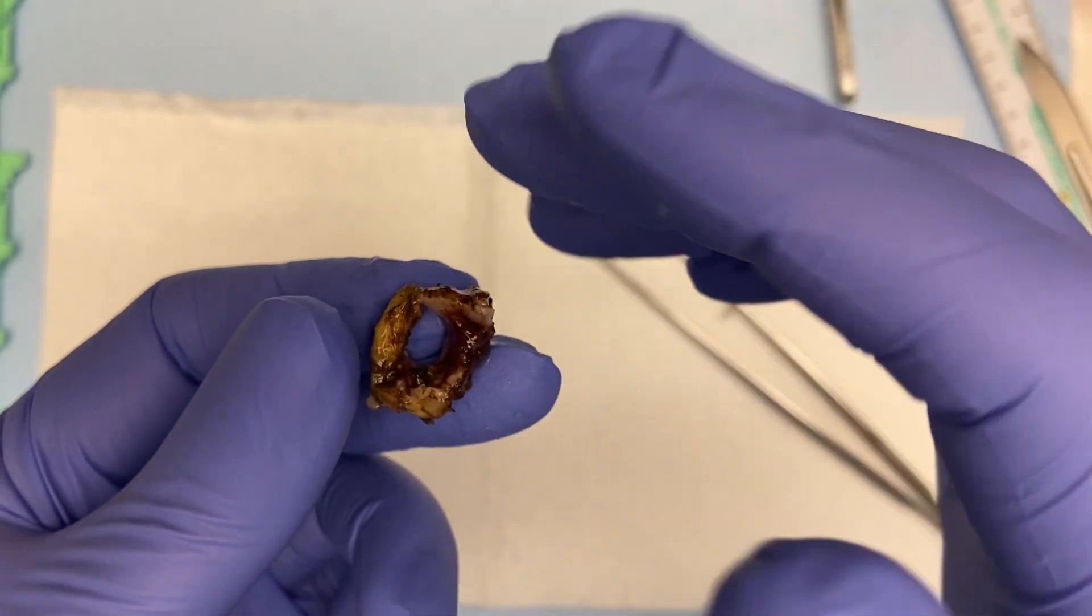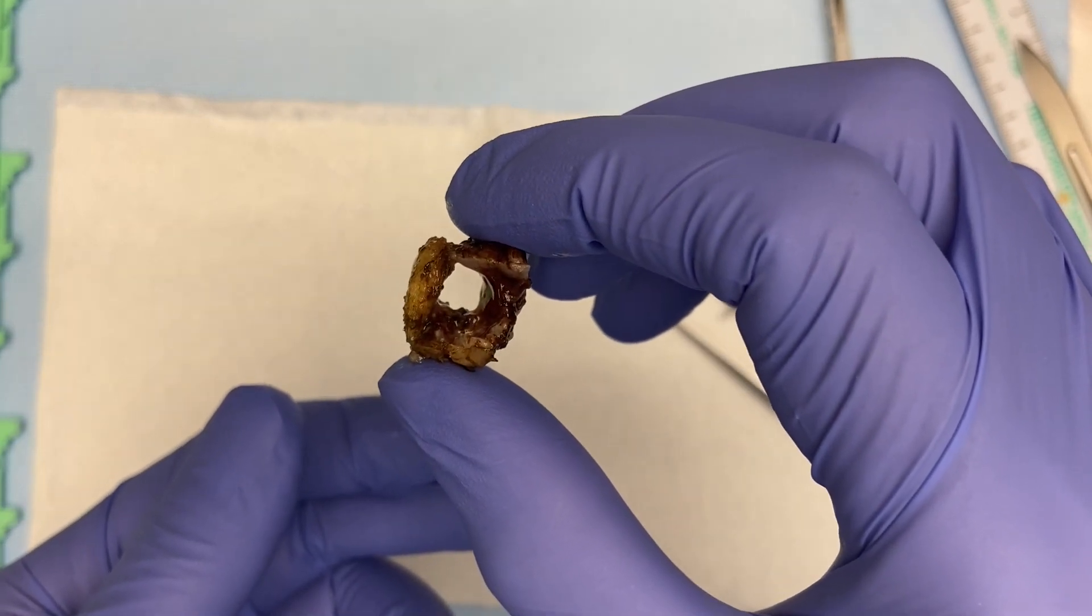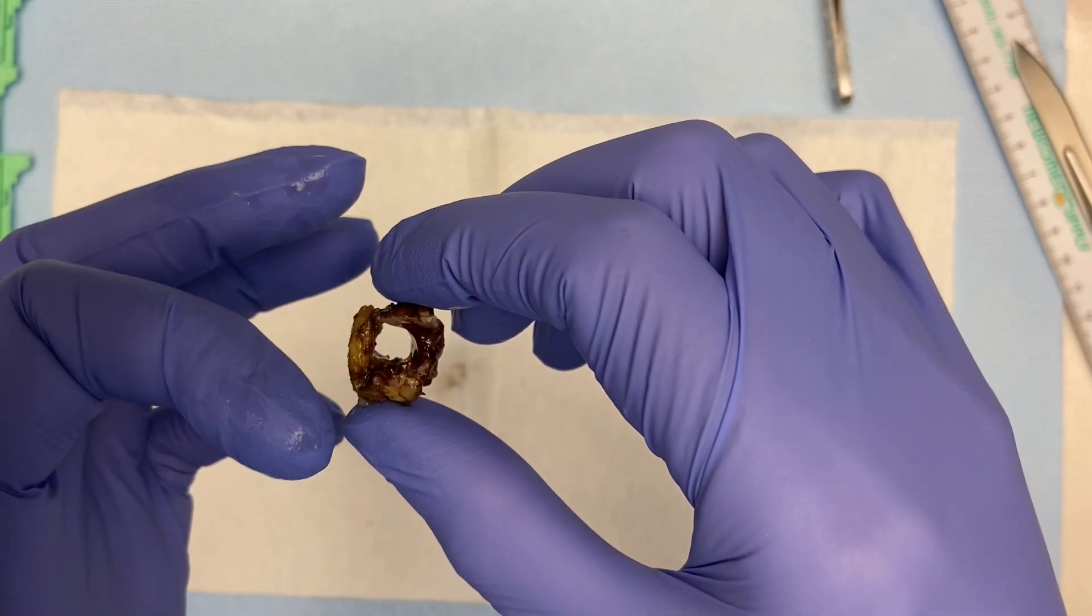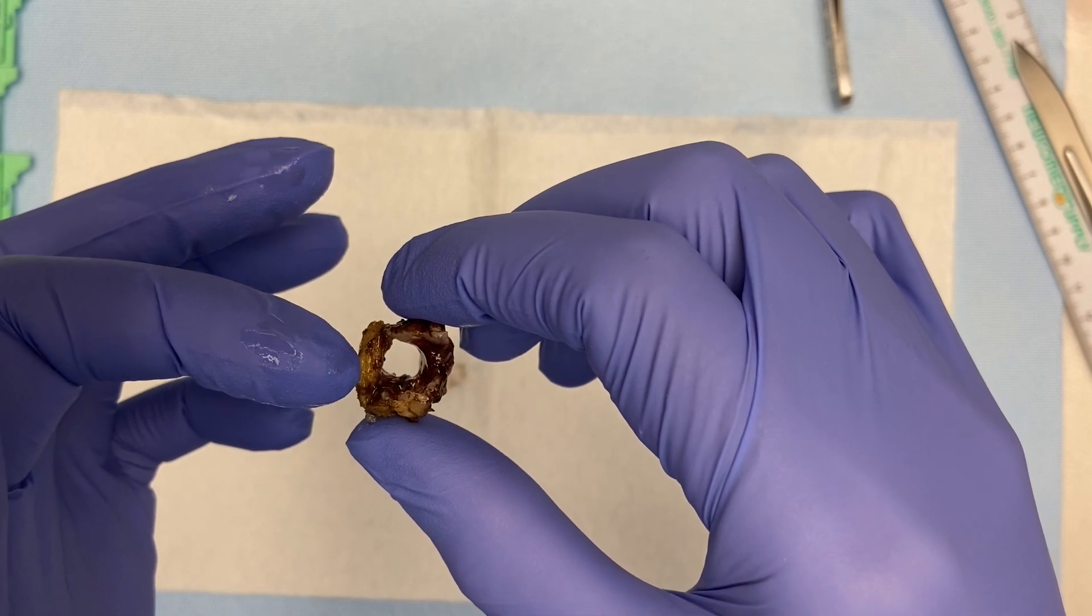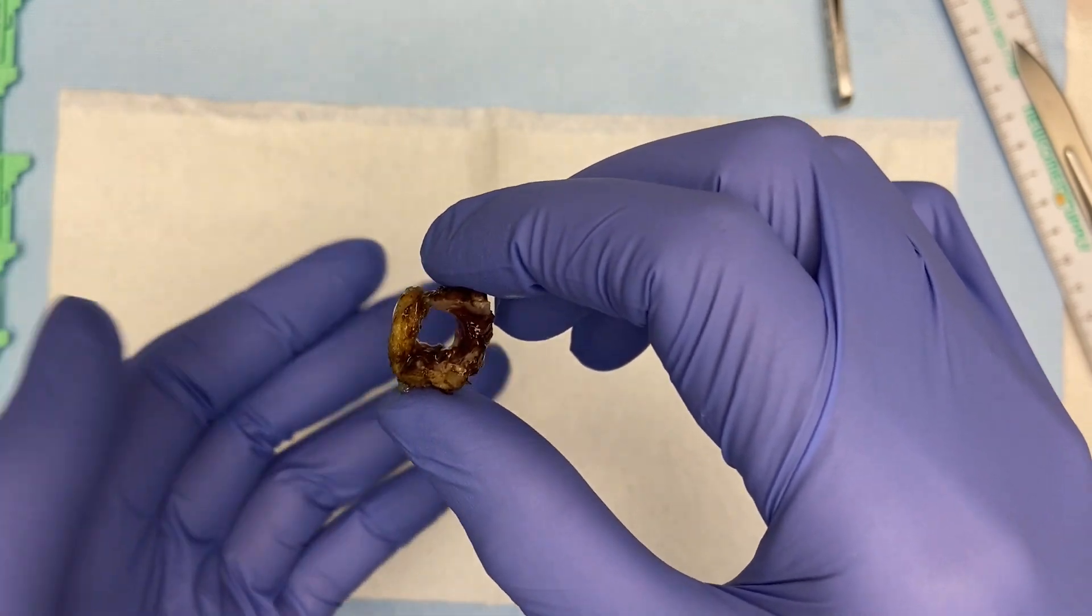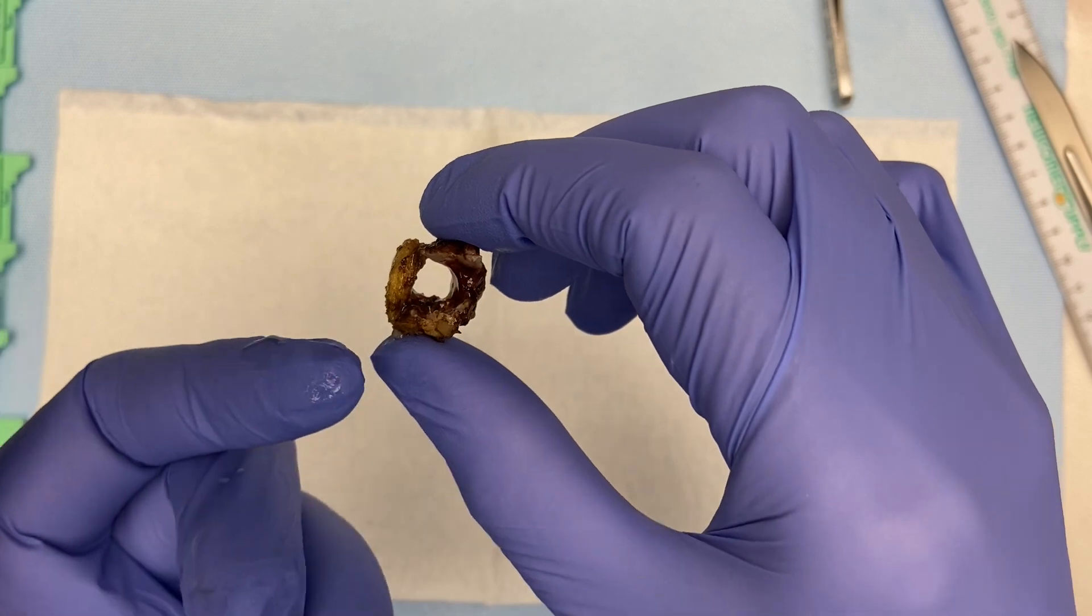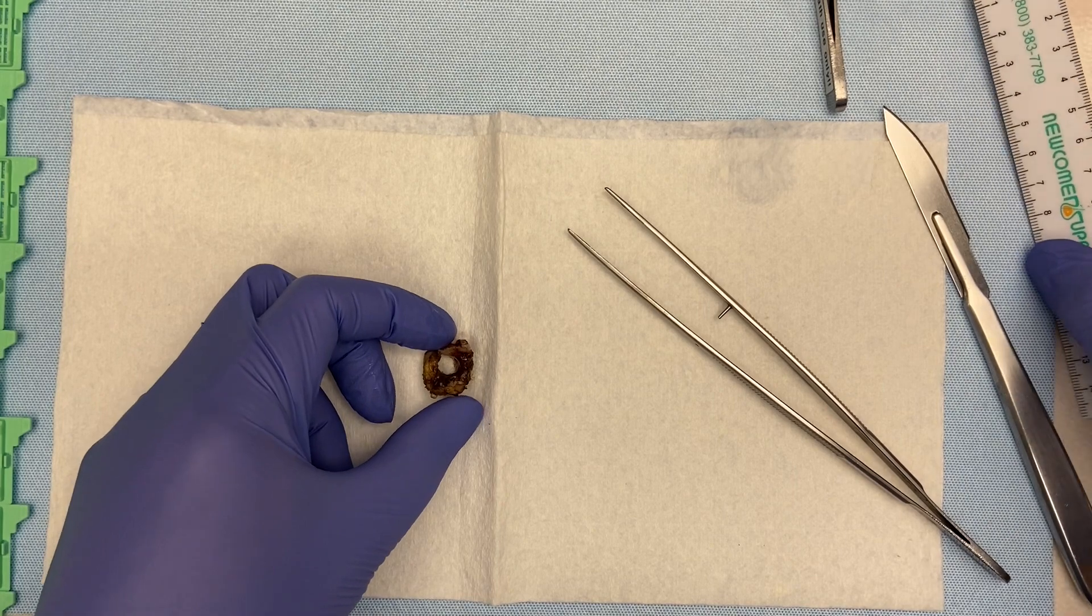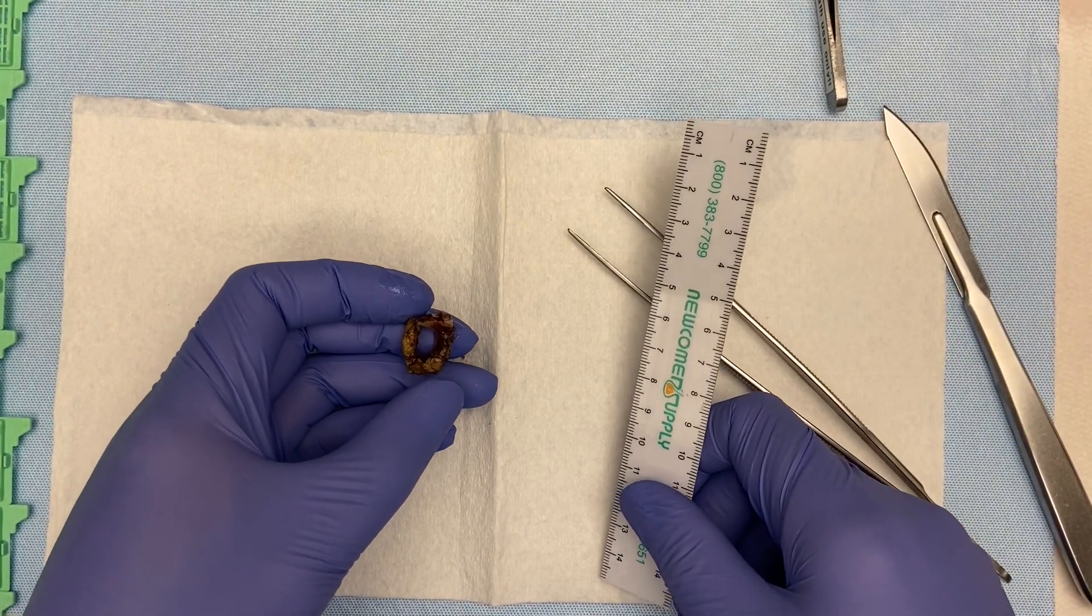Here what I'll do is I'll actually put only one piece of tissue in each cassette versus you could do maybe the 12 to 3 o'clock in one cassette, the 3 to 6 o'clock in one cassette, 6 to 9 o'clock in one cassette, and then again 9 to 12 o'clock in the last cassette, four cassettes. But we don't have a lot of faith in histology so I just leave it one piece per cassette to make sure everything gets oriented right.